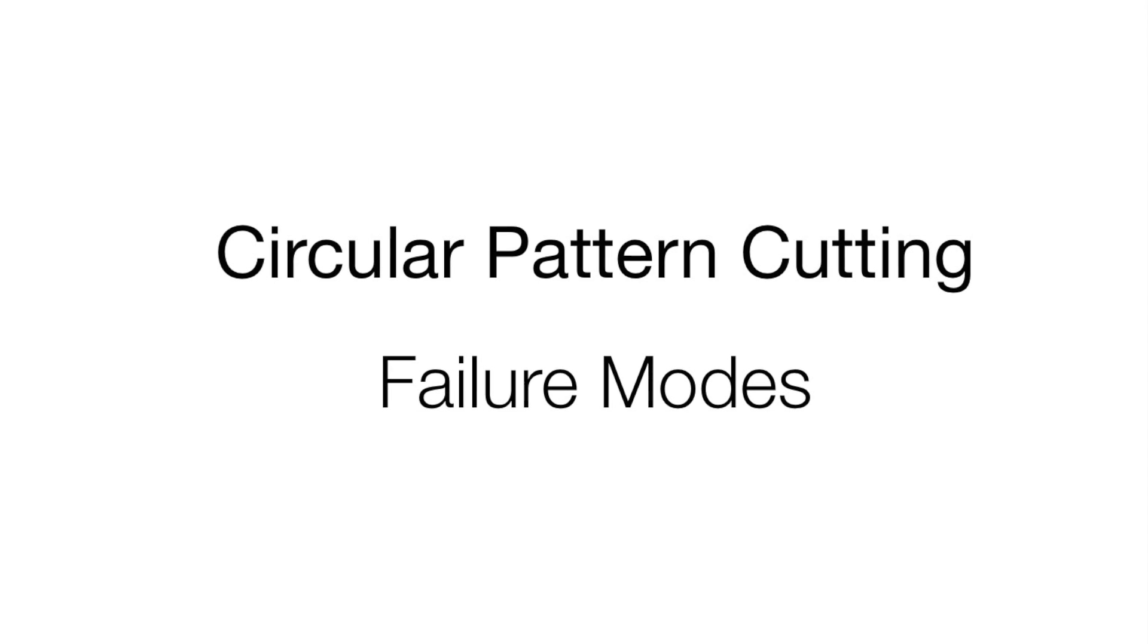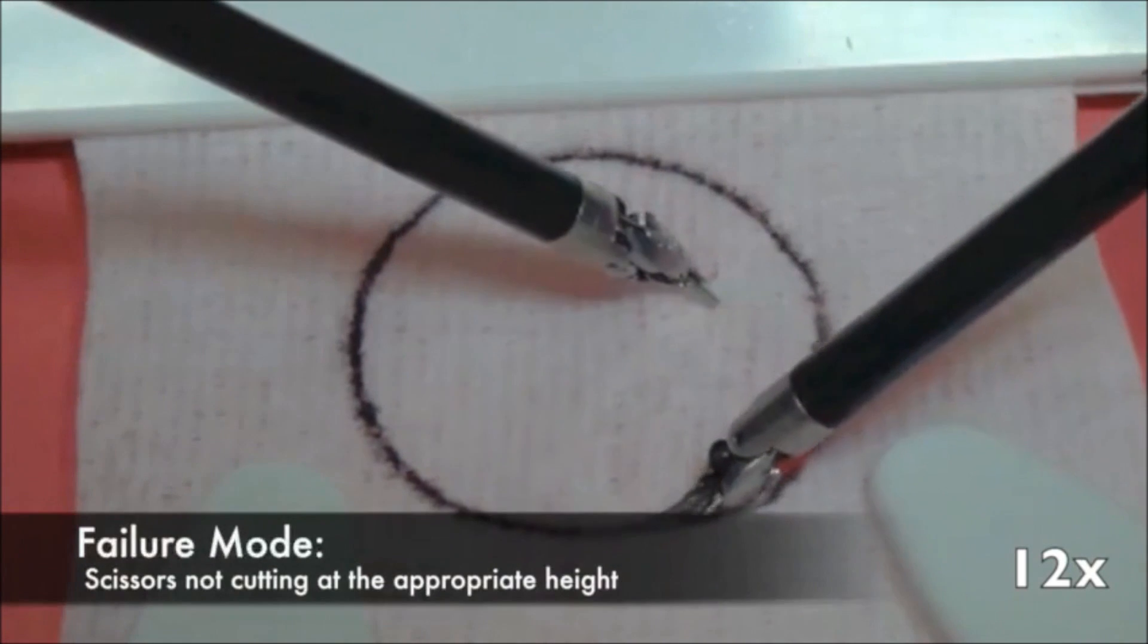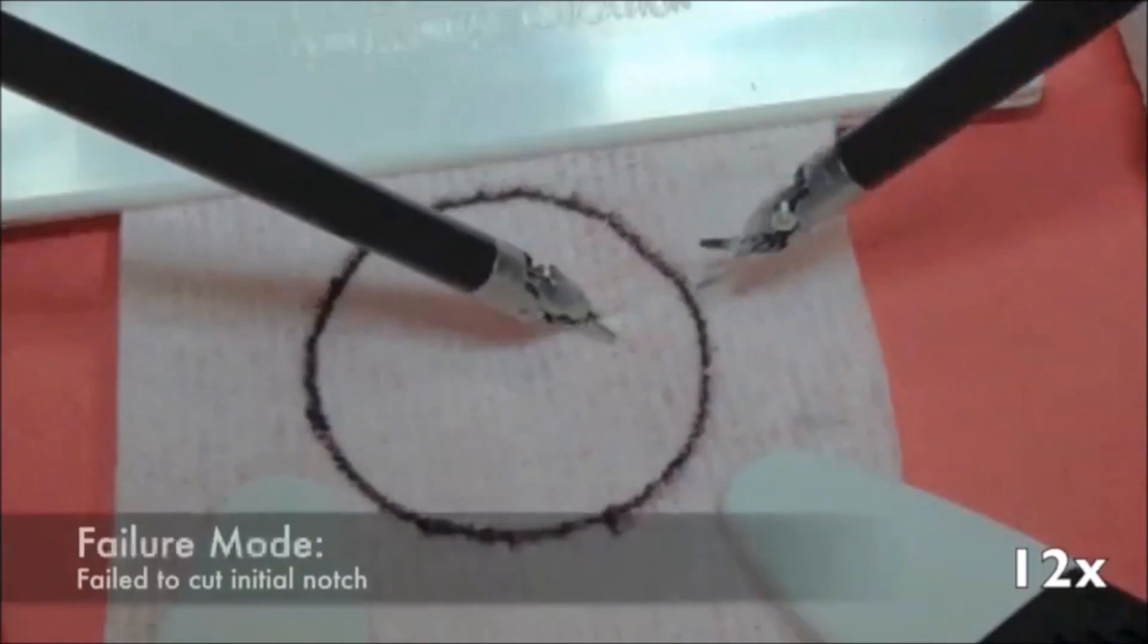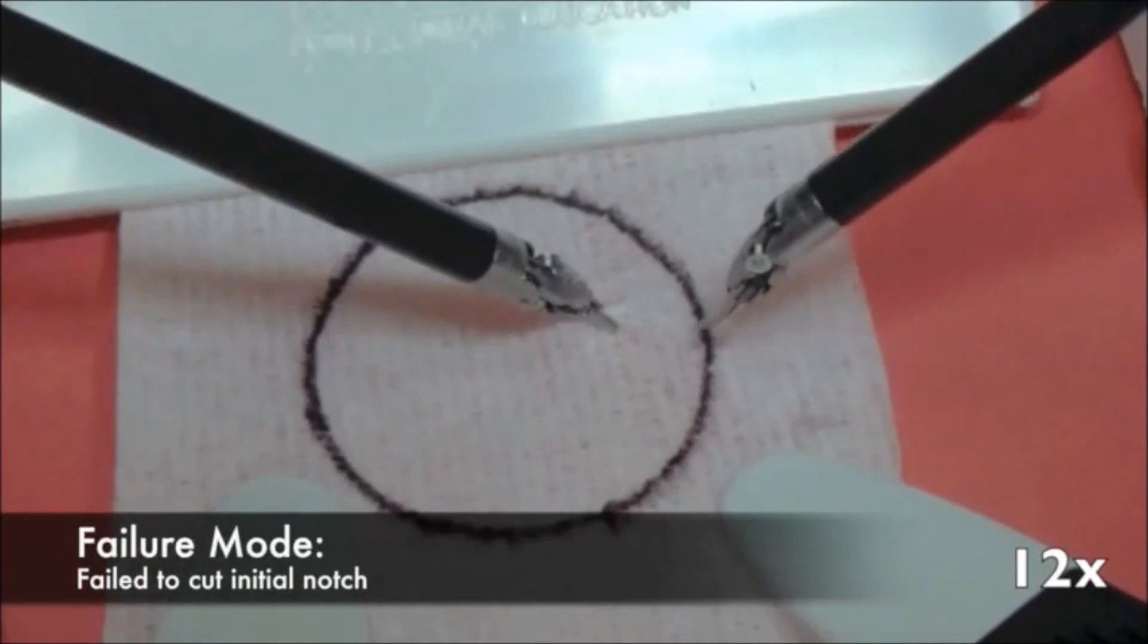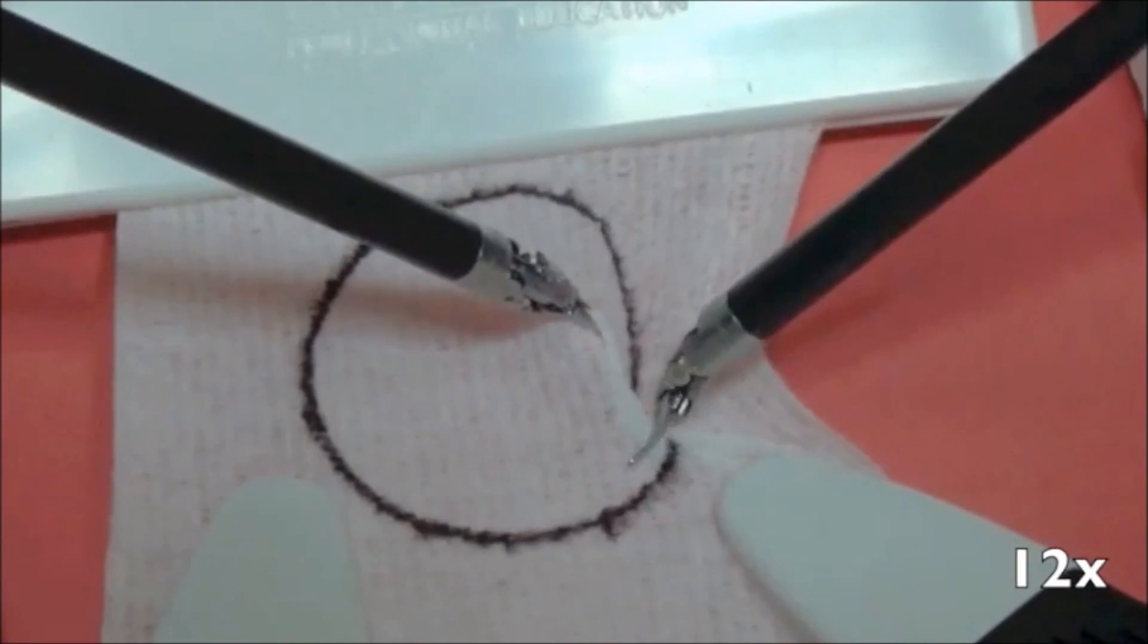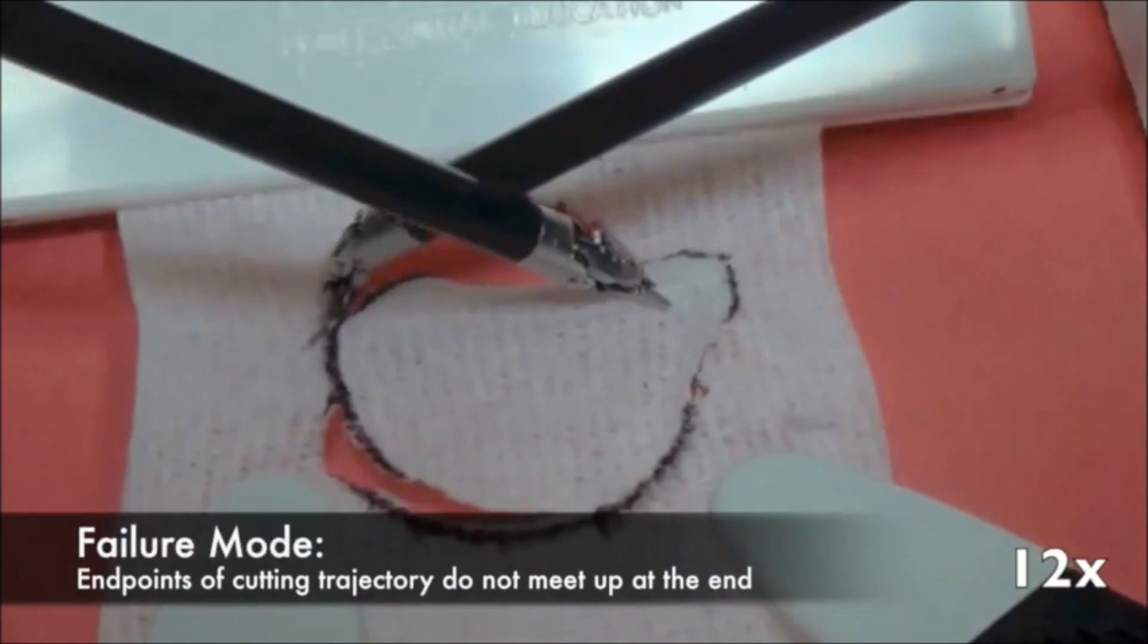However, not all trials were successful. We show here failure modes of this subtask. We are working to improve robustness for future work.